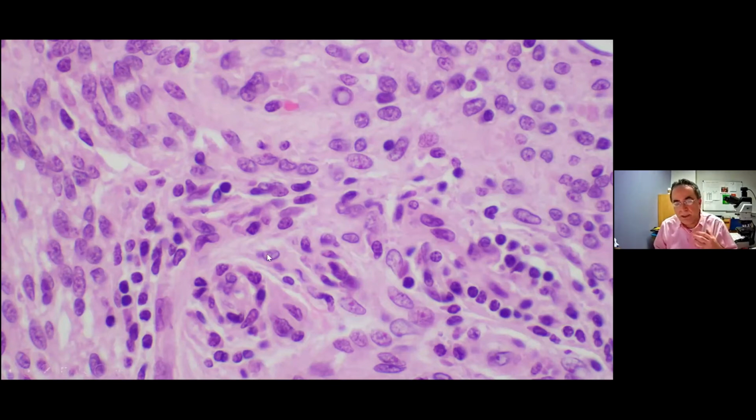It's called a pseudo-inclusion because it is an invagination of the cytoplasm into the nucleus rather than a true inclusion of the nucleus. Also, if you look at the nuclei, there is minimal variability in size and shape, so there is no atypia or pleomorphism. So there are no high-grade features.